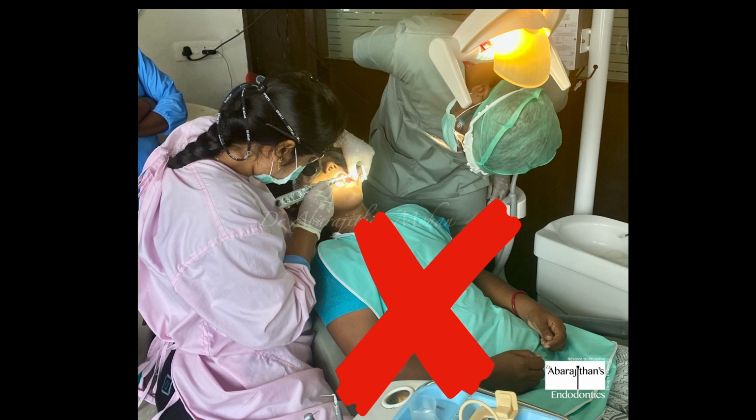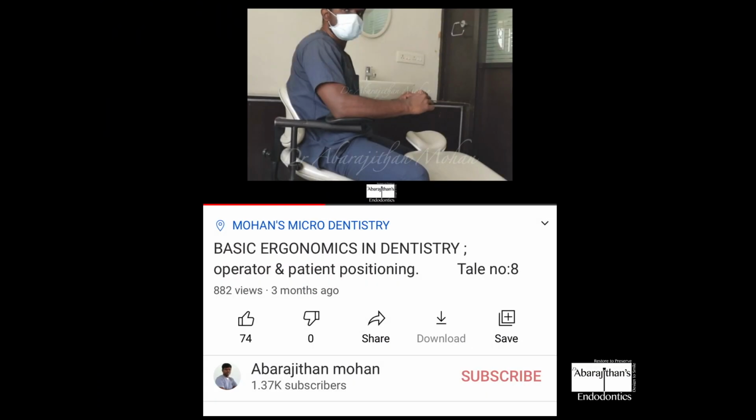In one of my previous tales on the basics of ergonomics in dentistry, we had already discussed the hazards of faulty chair positioning or operator positioning and the impact that can have on the dentist's musculoskeletal problems. So people who have missed that, here is the link or here is the description of that video. You can have a look at it, especially beginners who don't use magnification. This basic ergonomics demonstration will be very useful for you guys.